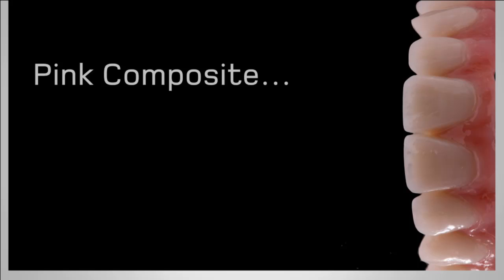You can also use composite, and this is a slightly more expensive option for your patients. But in terms of aesthetics, again, you're going up slightly in the aesthetic delivery, or the way that the final results will look for your patients.